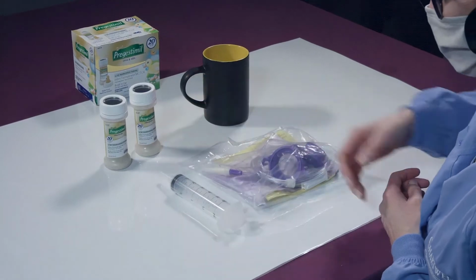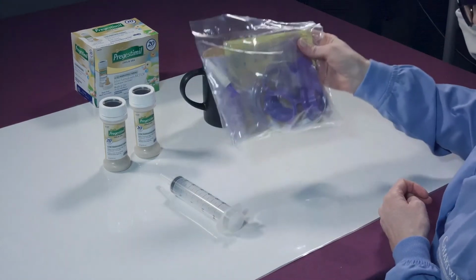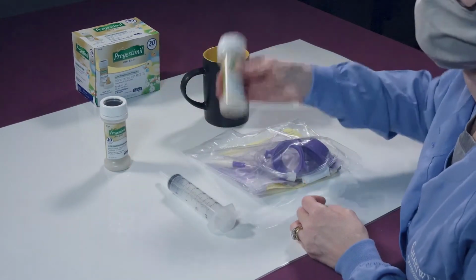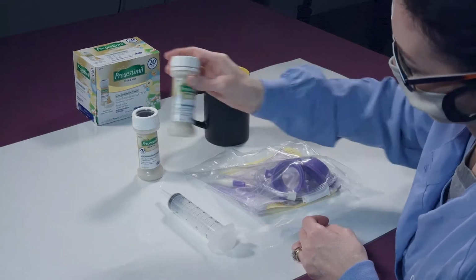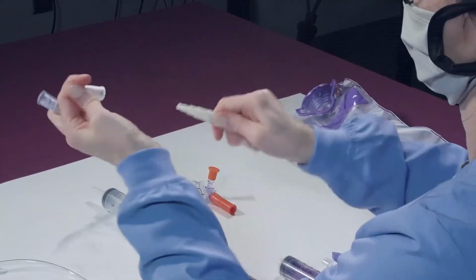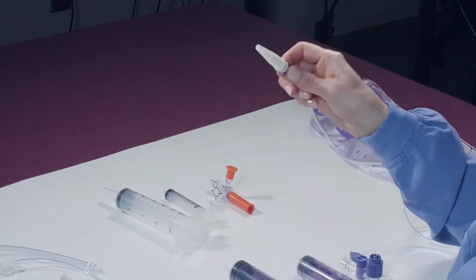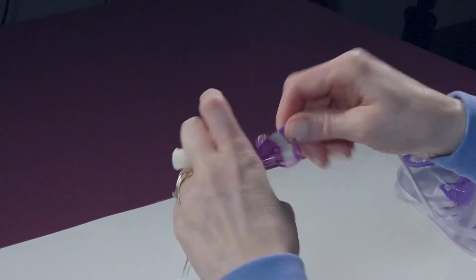Gather the ordered amount of formula for your feed, cup of tap or bottled water, IV pole, gravity bag with tubing, and your 60 cc syringe. Follow the packaging instructions, as the formula may need to be shaken if it is in a can or bottle, or kneaded if it's in a bag container. For traditional feeding tubes, you will use the cone-shaped connector that looks like this. For ENFit feeding tubes, you will unscrew the cone-shaped connector like this and connect it to your ENFit tube.